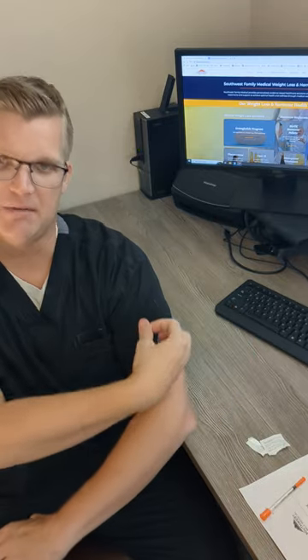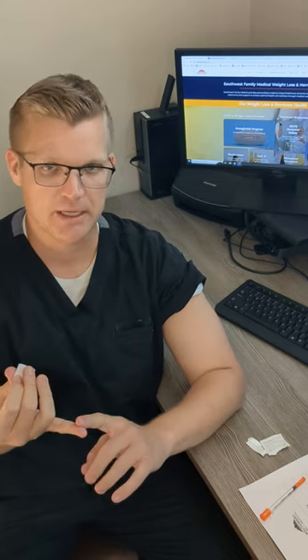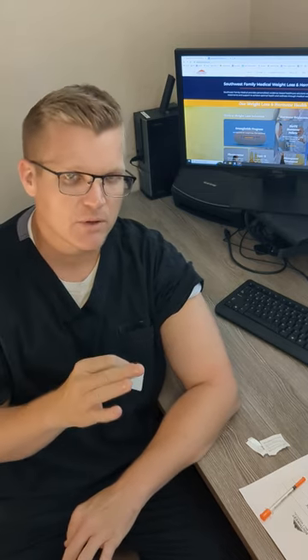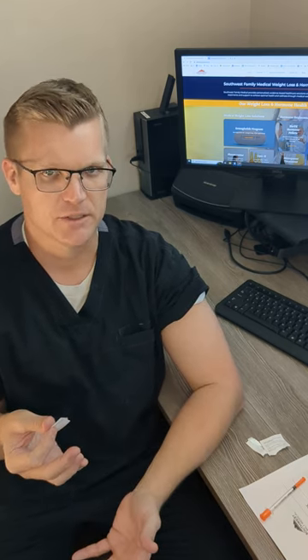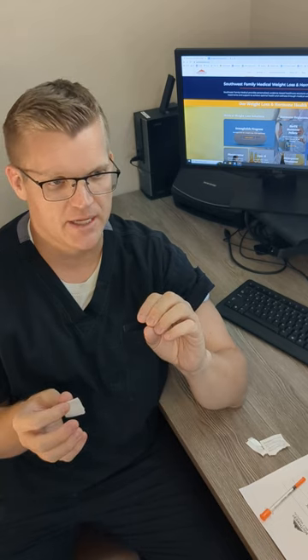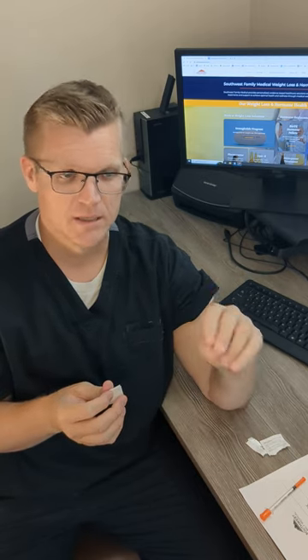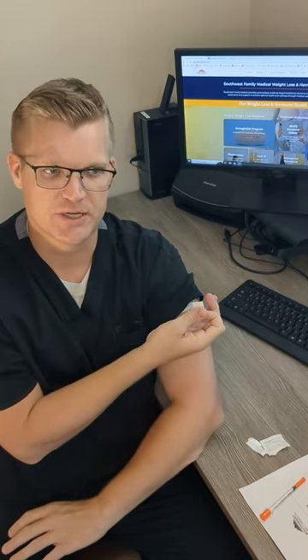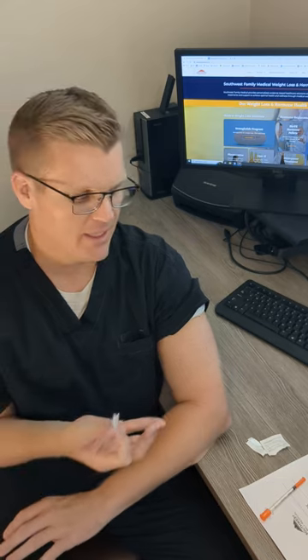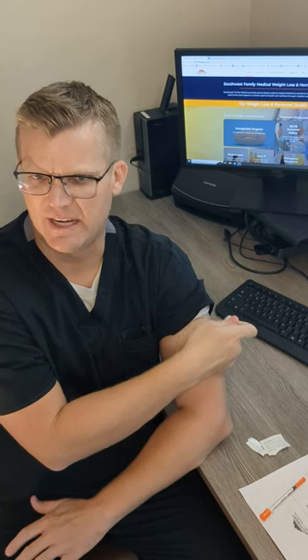I'm going to demonstrate in my arm right here. Injections for semaglutide and testosterone can both be done either subcutaneously or intramuscular. There's a misnomer that testosterone has to be intramuscular — it does not. Our recommendations are twice a week, Monday and Thursday for your T, either sub-Q or IM. I'm going to demonstrate the IM version. Depending on your size and body type, it may not even be IM, depending on how large your arms are.